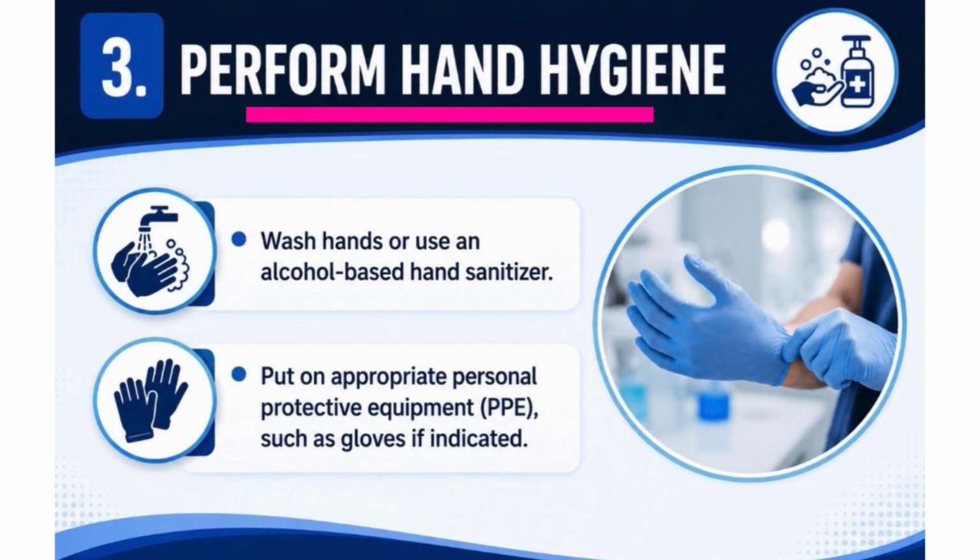Okay, you want to perform hand hygiene. You always want to wash your hands, or you can use an alcohol-based hand sanitizer, and you want to don your gloves. You don't want any medication getting on your hands, or if you have any cuts or anything on your hands, you don't want medication to get in them. You always want to wear gloves. Okay, so let's go on to the next one.